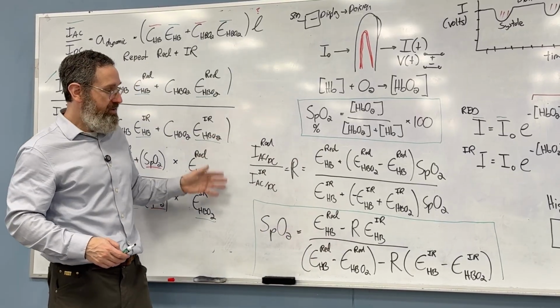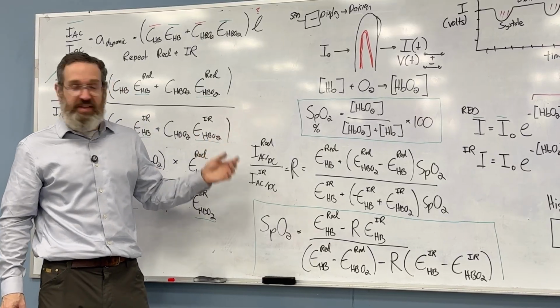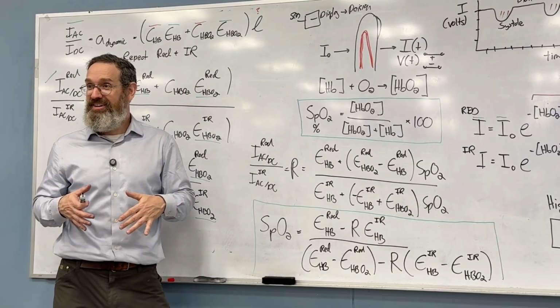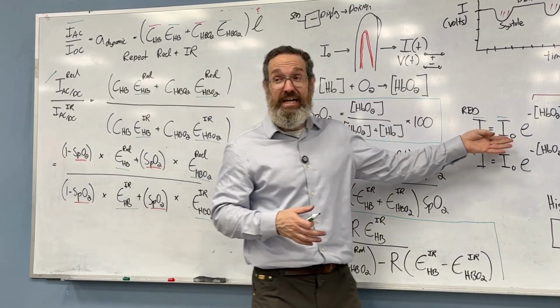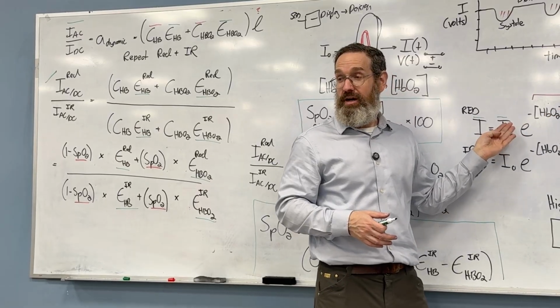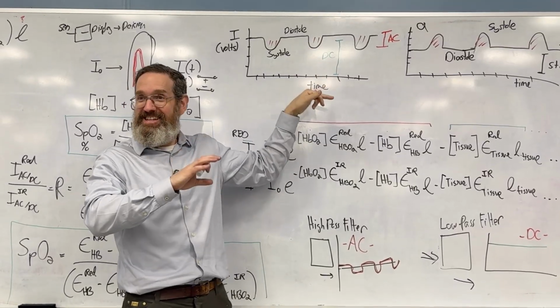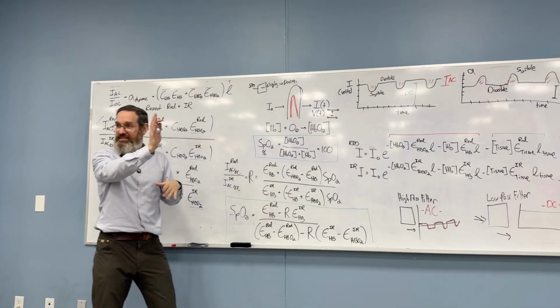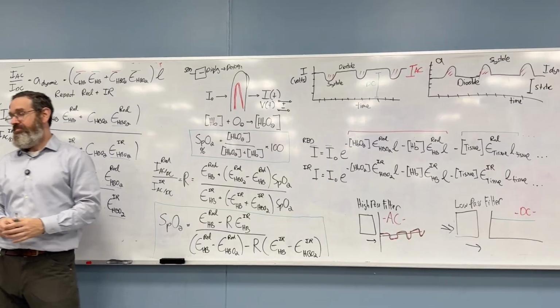So the whole point of this derivation isn't so that you could memorize it or I could test it on you. It's that you understand that it's all Beer-Lambert. That the only thing you needed to accept was Beer-Lambert. And once you accepted Beer-Lambert, now there are little tricks, like the AC and the DC and this little substitution we did here. Little tricks that maybe would be hard to anticipate on your own, and voila.